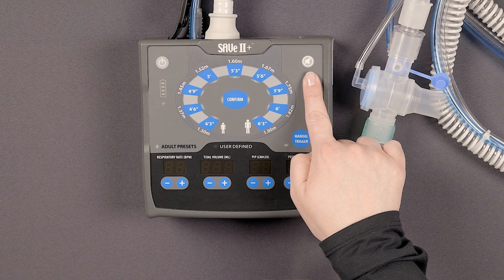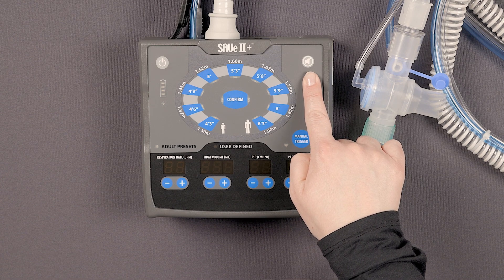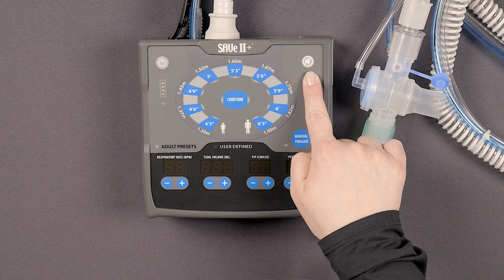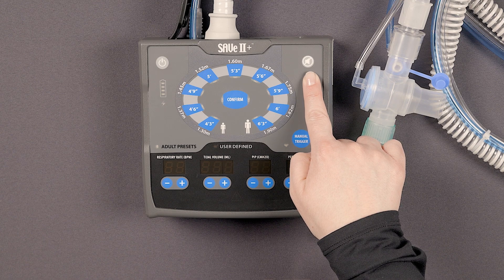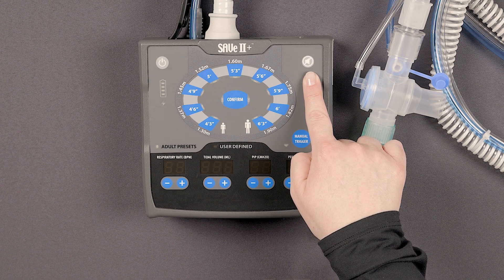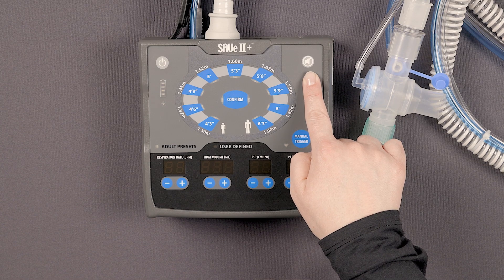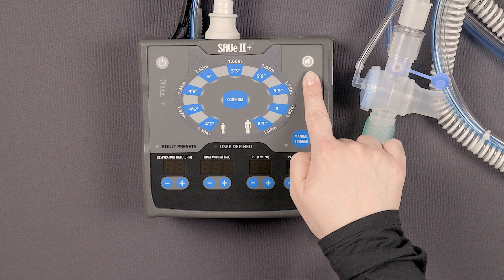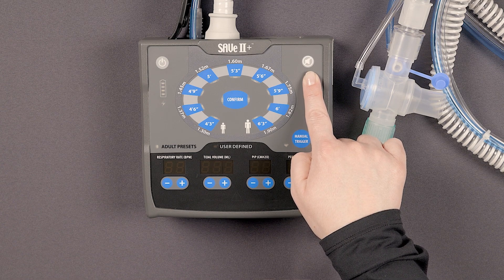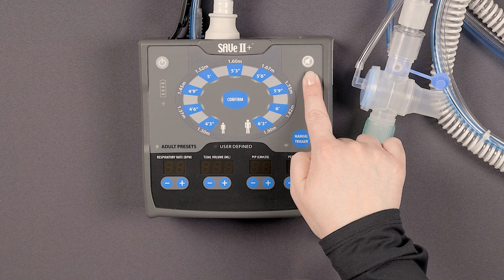And lastly, this button will mute an active alarm for 120 seconds. If the alarm condition still exists after 120 seconds, the audible alarm will resume sounding. Also, if a new alarm needs to sound and the mute button is on, the new alarm will override the mute and the alarm will sound.